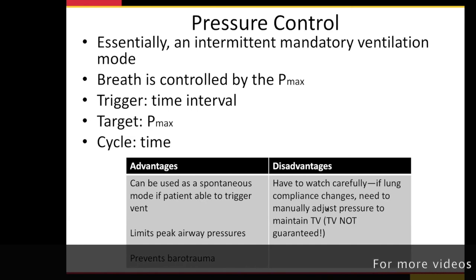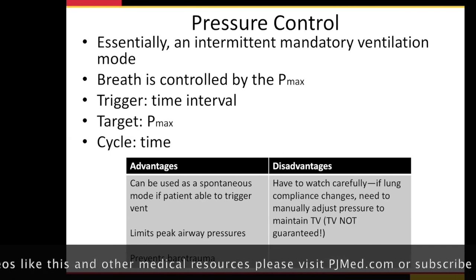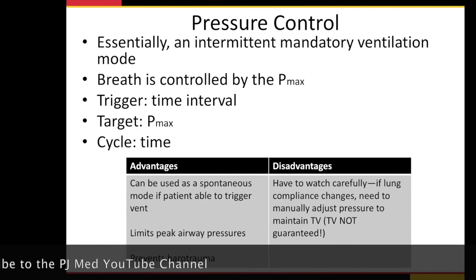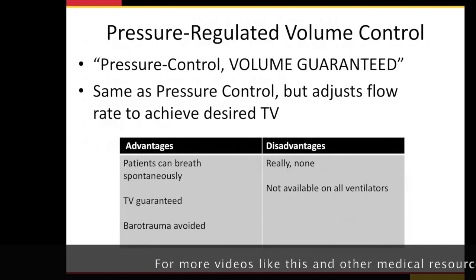And the problem is, if they're in a room that's negative pressure, you can't do that very easily because that means you have to go in and out of the room over and over. So we're struggling with this. We're bringing the vent outside the room, which is a great move. I would argue if you can do that, great. You can just extend the tubing, the vent tubing. That's one technique to keep your eyes on this. Then you have a hybrid mode here.